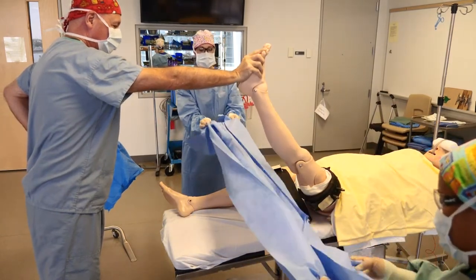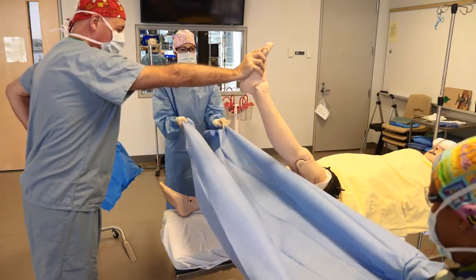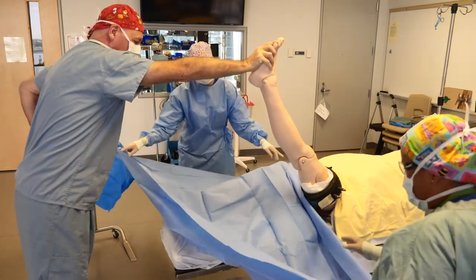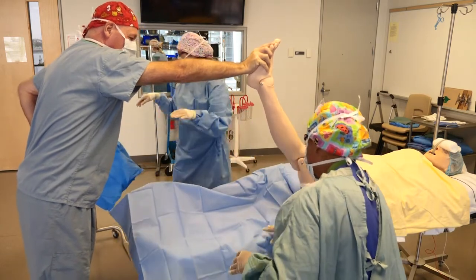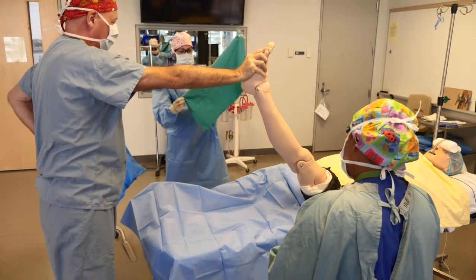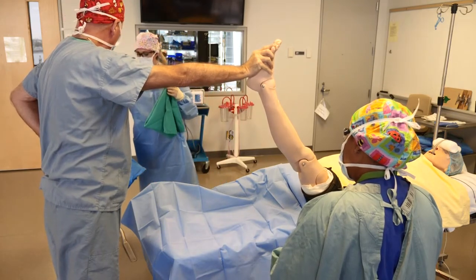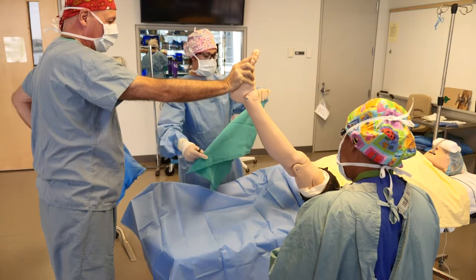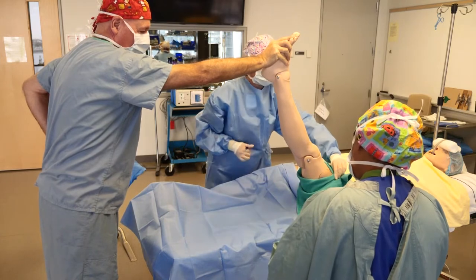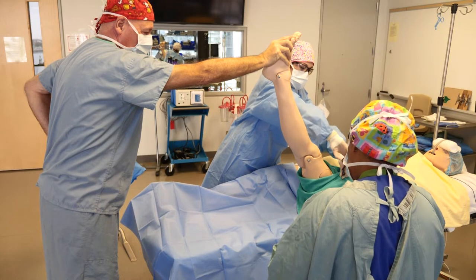We have the scrub nurse receiving the other end of the drape, and they will then unravel the drapes. The resident is using a towel folded as such to cover the patient's tourniquet, and a towel clip is used to secure it in place.